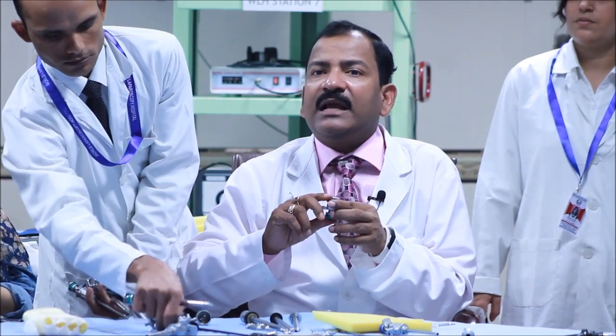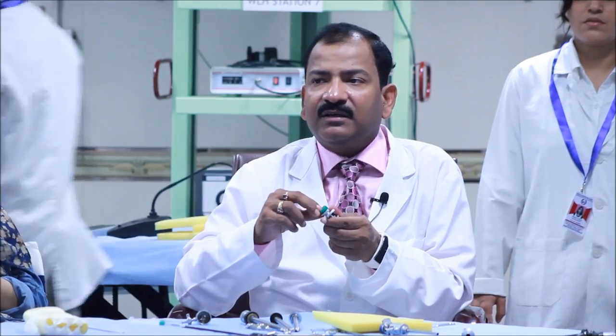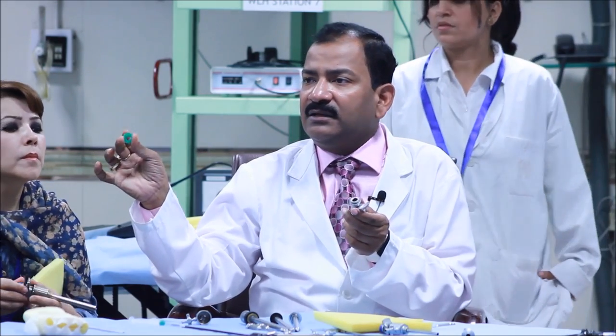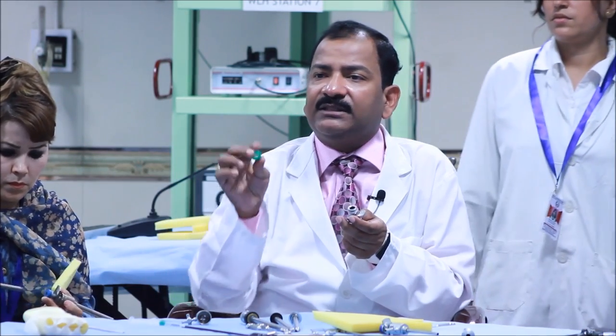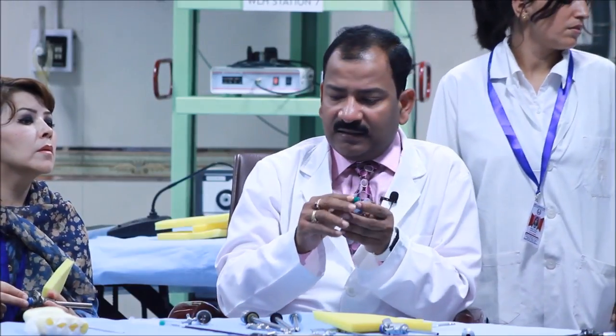So there are two types of seal. One is called the valve seal, another is called the washer. This washer is on the top. This is also a replaceable part, which from time to time you have to change. This washer is on the top. This is also a type of seal. And this is a valve.